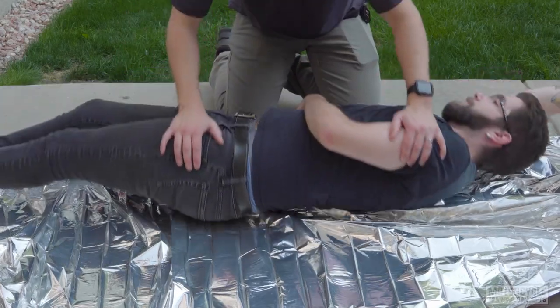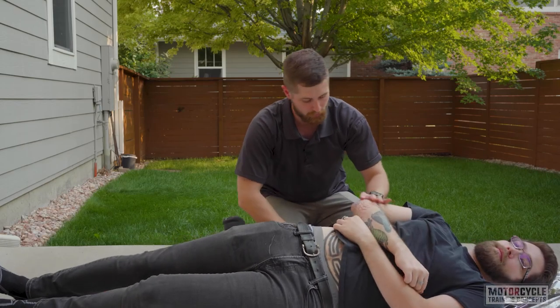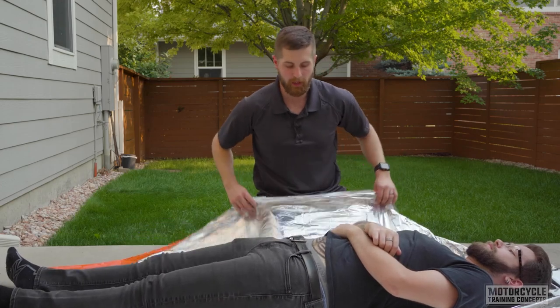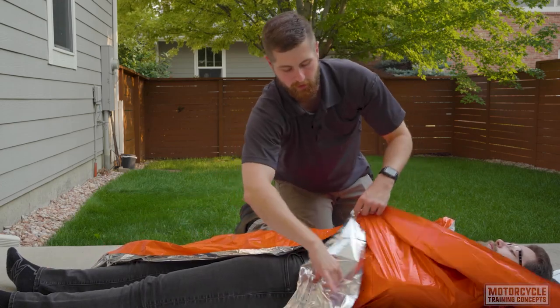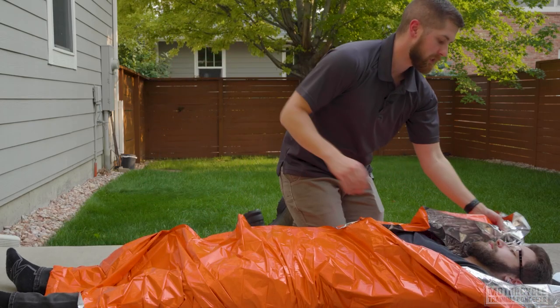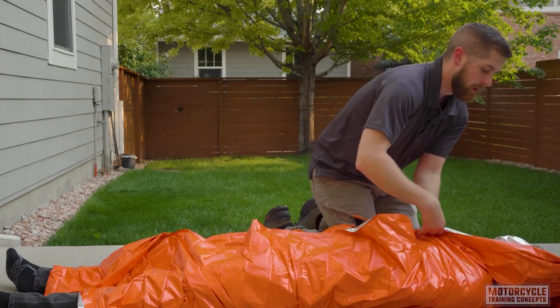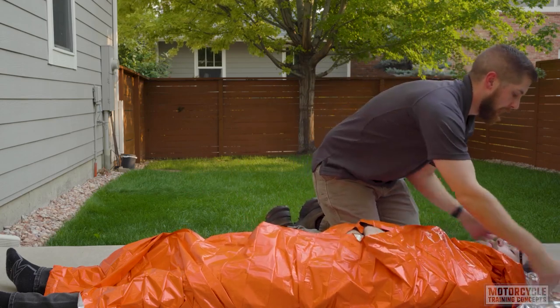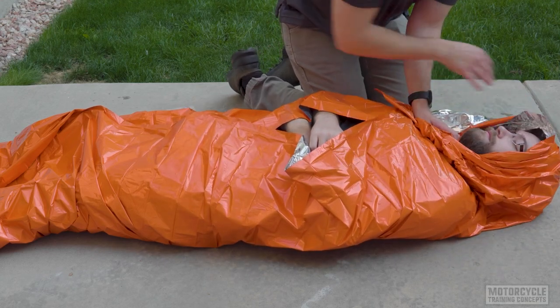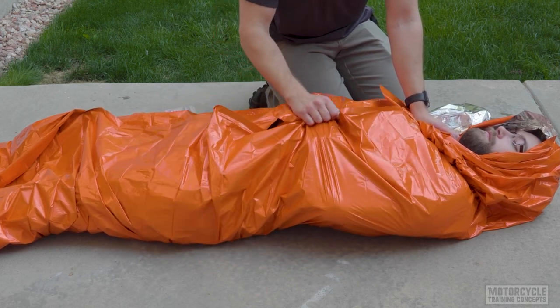Now that that's there, I'm going to roll him back, and we're going to do a small roll in the opposite direction to get the other section of the blanket and bring them down. I can then take both ends of the blanket and bring it around them to encompass them. I left a lot up here at the head — I can take that and cocoon their head slightly. We can then secure this with tape. The head has a lot of surface area and I want to make sure heat's not escaping in that direction.